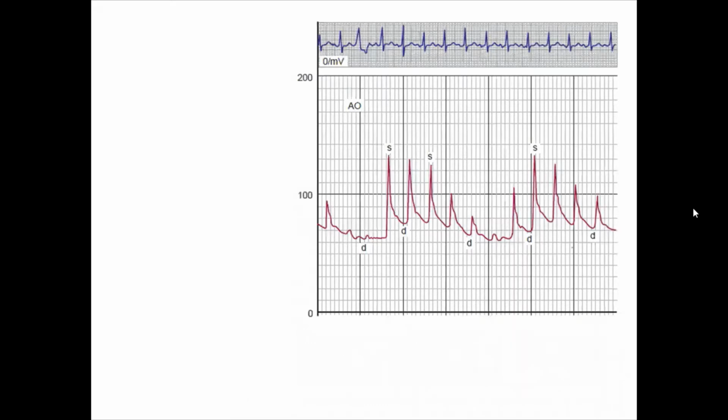If I told you this is aortic hemodynamic tracing, describe what you are seeing. So what do you see here? There is gradient in the aorta. We have only one vessel, only aorta. In the aorta, usually pressure is phasic, systolic, diastolic. We have a normal value of 120/80 around this one. So what happened? This is hemodynamic tracing of the aorta with ECG tracing.